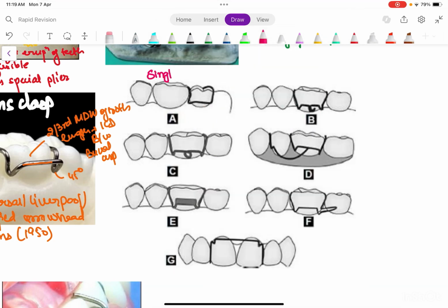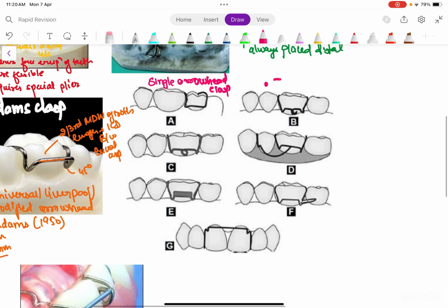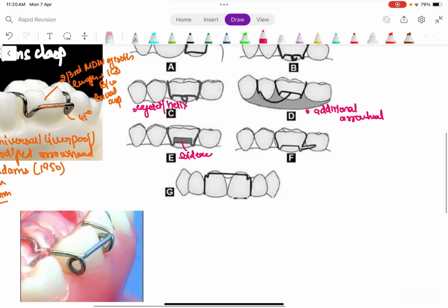So you can see there is no arrowhead here, just one arrowhead. So this is a single arrowhead clasp. This is with J hook. This is with eyelet or helix. Then this is additional arrowhead. Then this is with soldered buccal tube. This is with distal extension. This is on incisors.